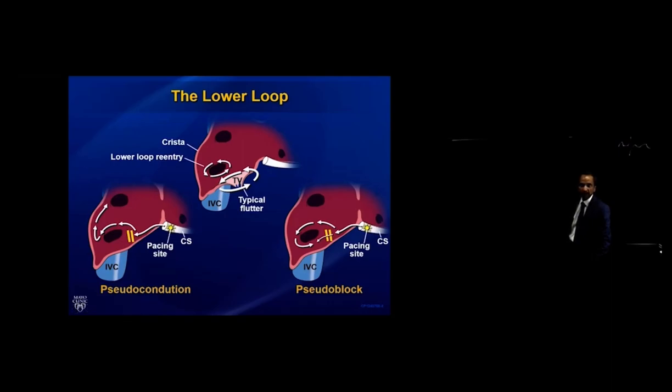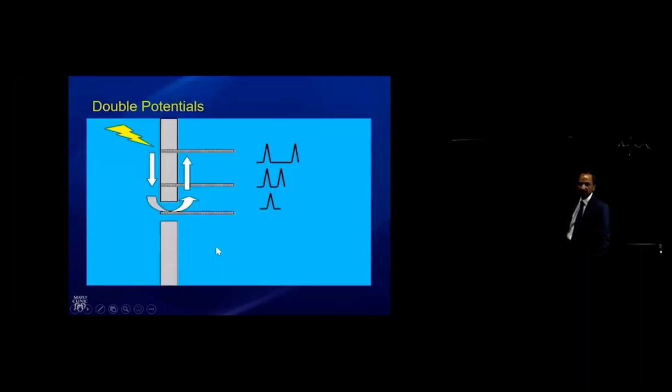The clue will be flutter continues and we're confused whether we made a wrong diagnosis, it's some other flutter, misinterpreted entrainment, etc. Solution is closely spaced catheters straddling where we ablated. However slow the conduction is, there will be some activation that's going and showing us that there still is conduction if there's dense enough electrodes, closely spaced electrodes, or an actual map that's done at that time.